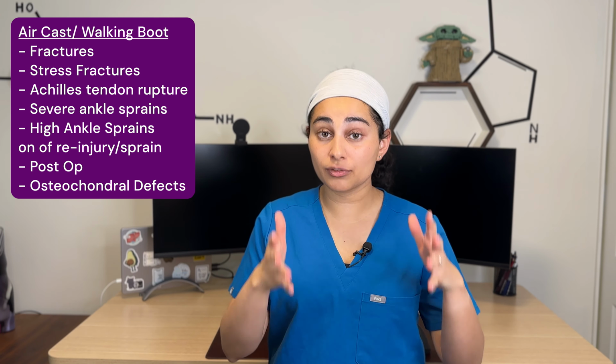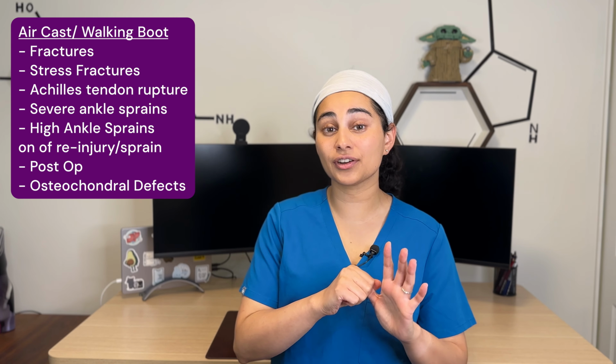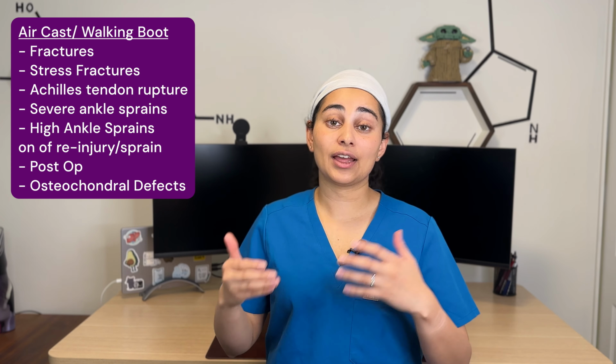And it can also be used post-op in a lot of ligamentous post-op reconstructions. And then the last area is cartilage damage in the actual joint. So some people can actually get an osteochondral defect, and the treatment for that is immobilizing the foot. This here is preventing you from moving your foot and ankle.